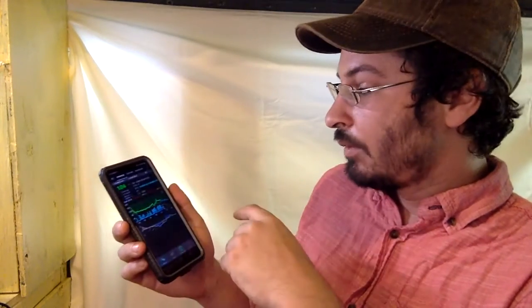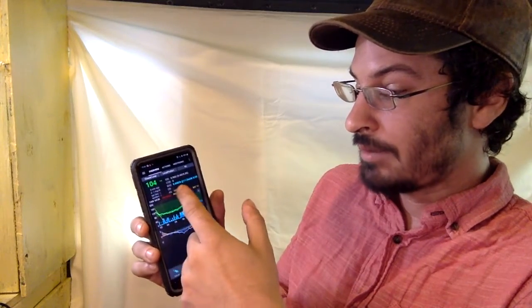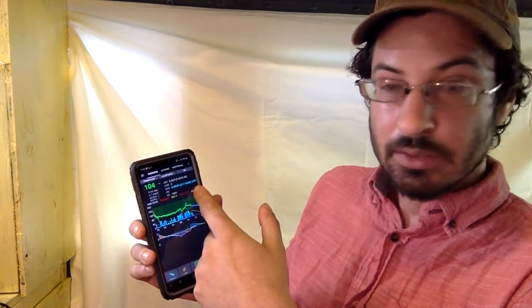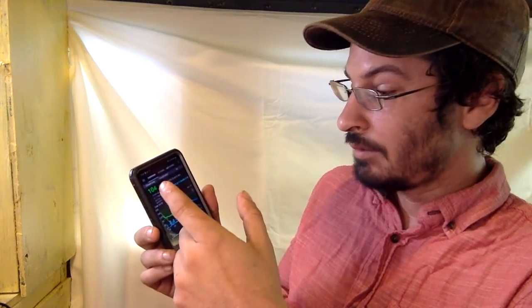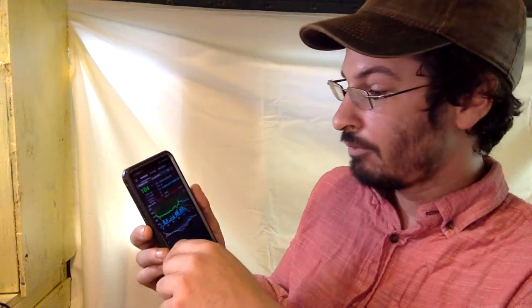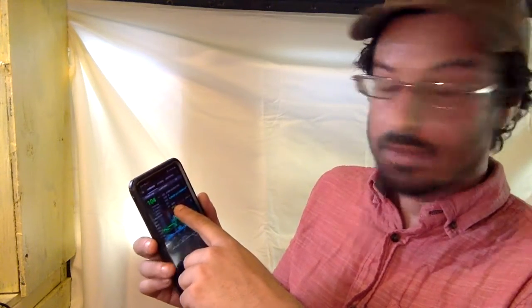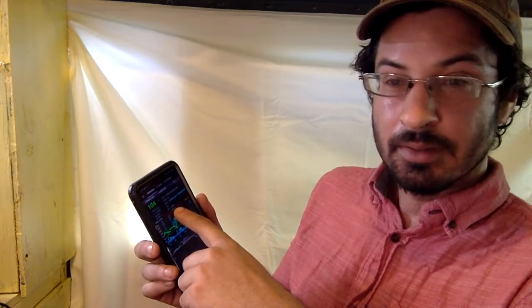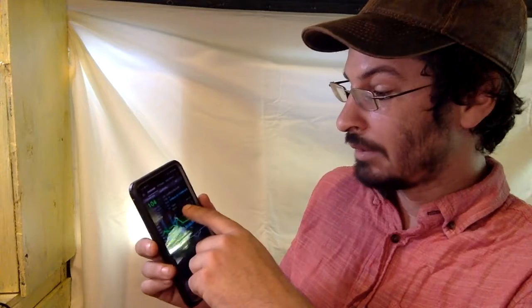Actions. One thing that was really useful for me, someone showed me you can add some data here, so it's always in front of you. My cannula has been in for a day and a half. My reservoir is yellow right now. I'll probably need to add more to my reservoir before I switch my cannula.